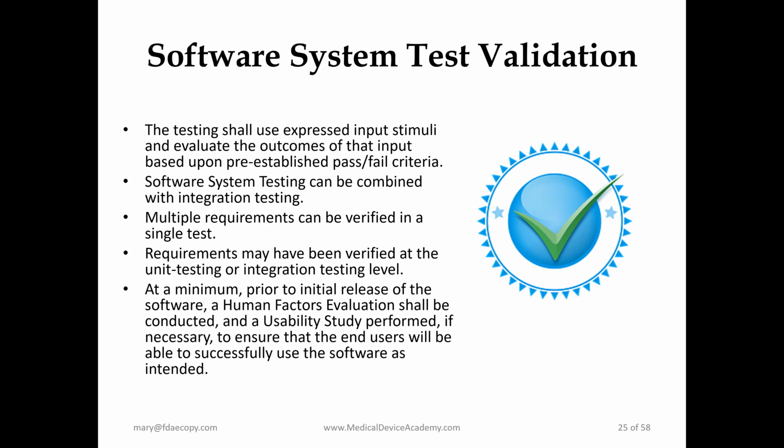So, looking at whether this has been required of similar devices, and then drafting your study protocol and presenting that to the FDA, or presenting an argument for why a study is not necessary, why you've considered all these human factors elements and you don't think it's necessary. That's something that might vary depending on your software, but it's definitely something you need to consider when planning out your validation activities. Next slide, please.